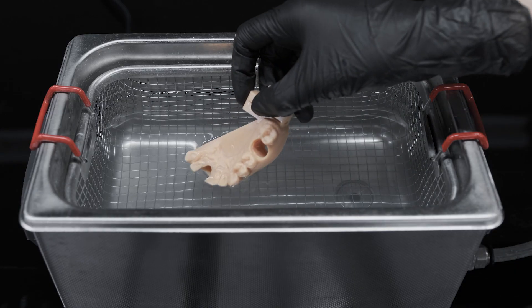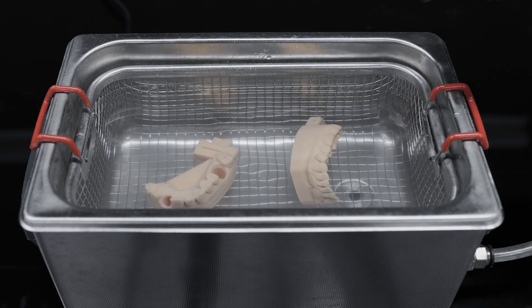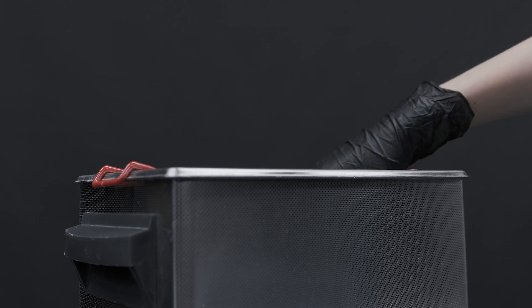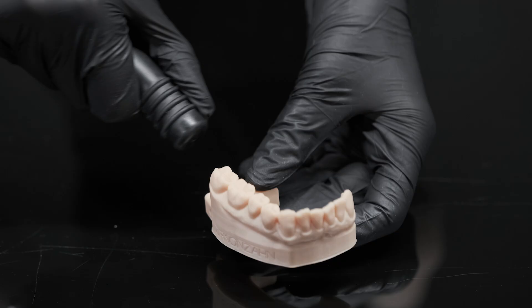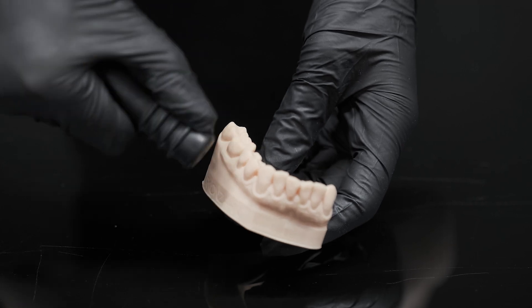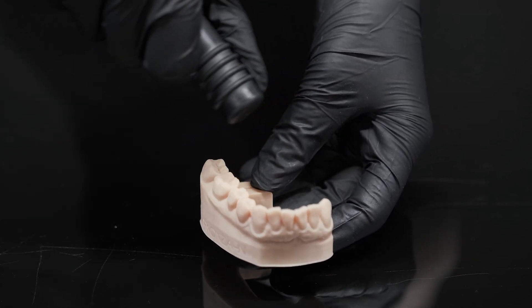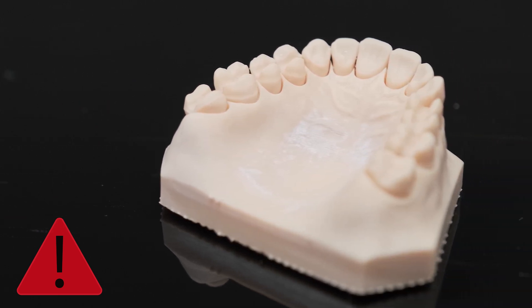Immerse the models in the ultrasonic cleaner with water at room temperature for 10 minutes. After that, take the models out and dry them with compressed air. If the model is not completely cleaned and dried, white spots will appear after curing, followed by the possible risk of sticky surfaces and model cracking.